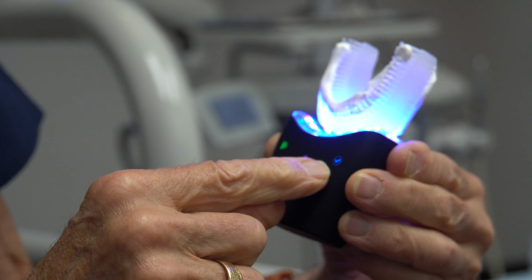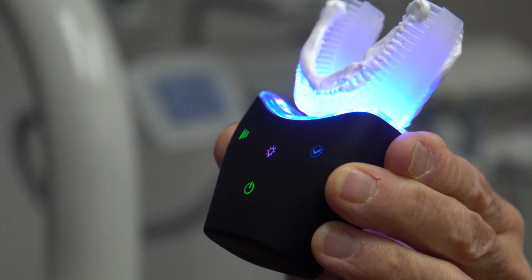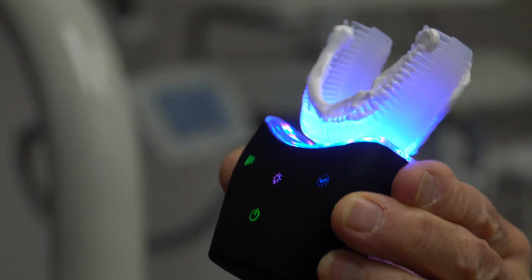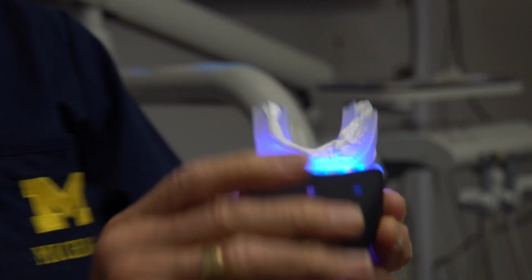so that blue light means it's going to be on for 60 seconds. We can do 30 seconds, we can do 60 seconds, we can do 90 seconds. So we're going to do 60 seconds. So here we go.